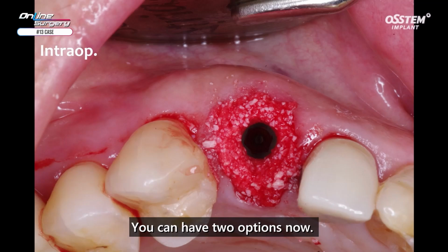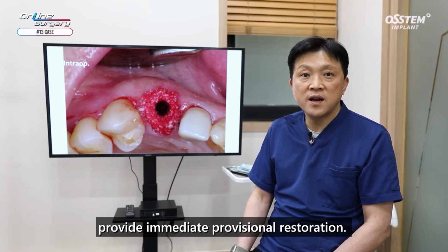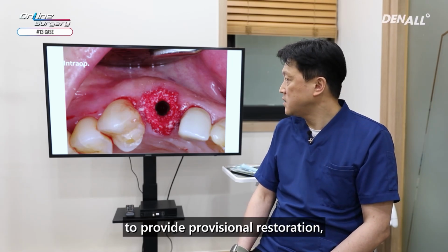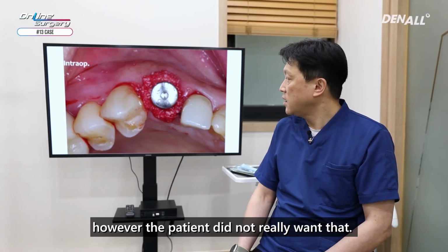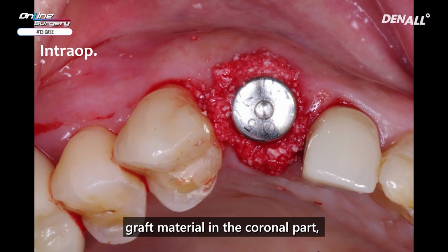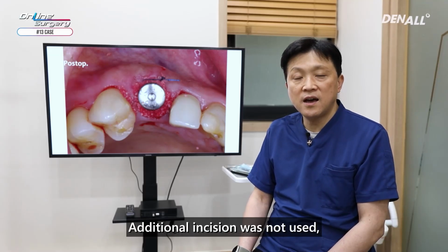You can have two options now. You can connect healing abutment or provide immediate provisional restoration. In principle, it is better to provide provisional restoration. However, the patient did not really want that. Therefore, healing abutment was connected. We can end like this, but in order to prevent scattering of graft material in the coronal part, sling suture was done once. Additional incision was not used.